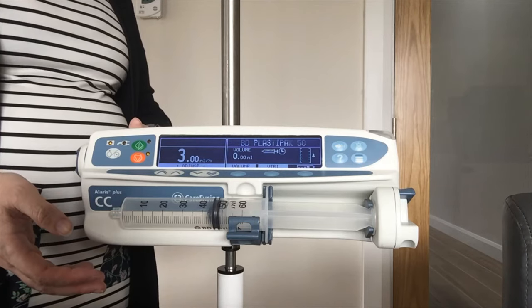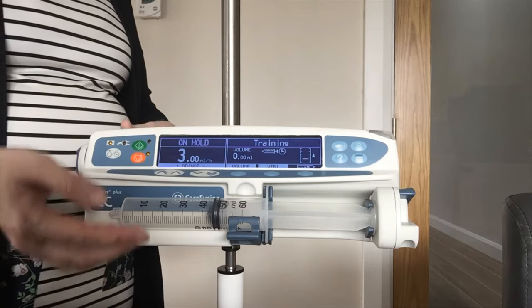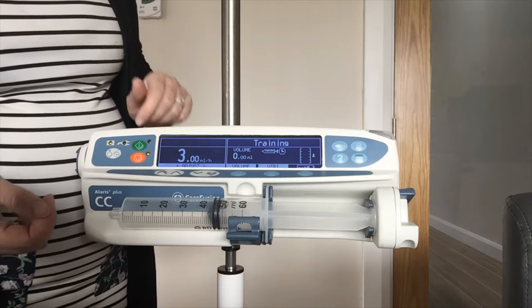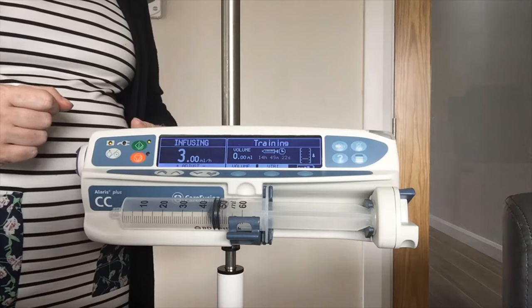That is all the information you need to put into your syringe pump — your rate — and it is going to recognise the amount of volume in the syringe. So once I am happy I am going to press the green to run to start my infusion.